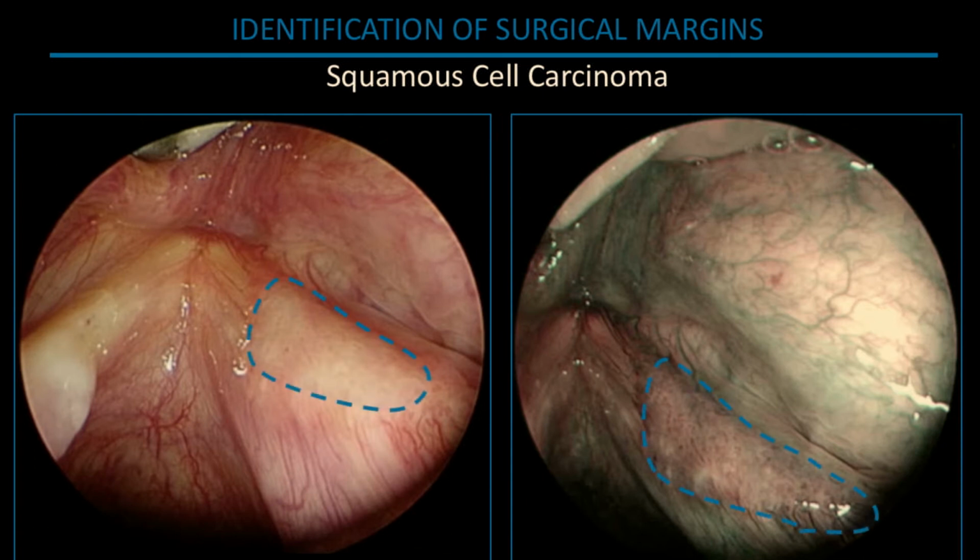Again, the macroscopic margins change completely. So if you have to plan the resection, you have to follow this margin and not this margin. So you have to make a wider resection. And of course, as Professor Farah will show you later, probably from this margin to the healthy margin, you have some biological or molecular changes.